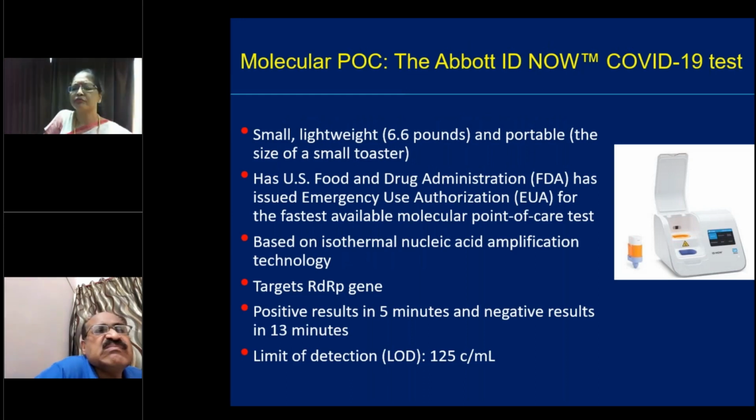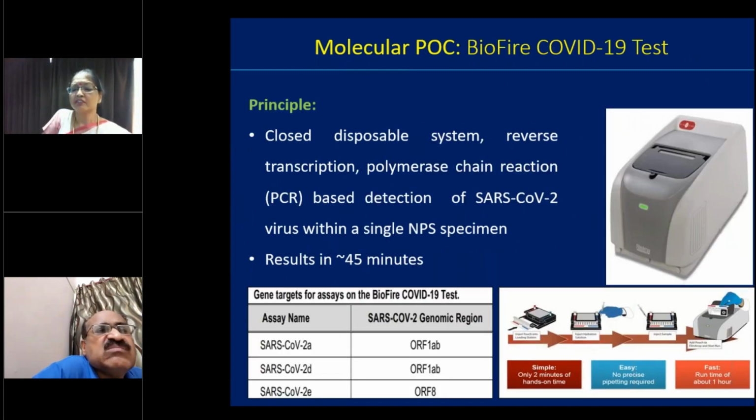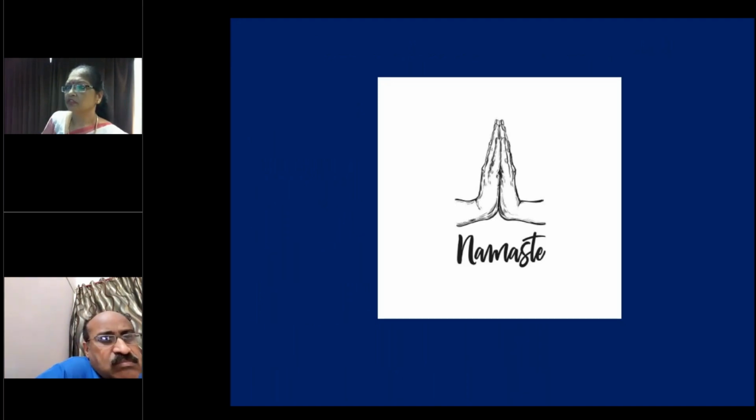So various types of tests are available in the market, but the principle remains the same. So I'll not go into the detail. Then we have this BioFire. Apart from this, you can detect other viruses also. So thank you very much.